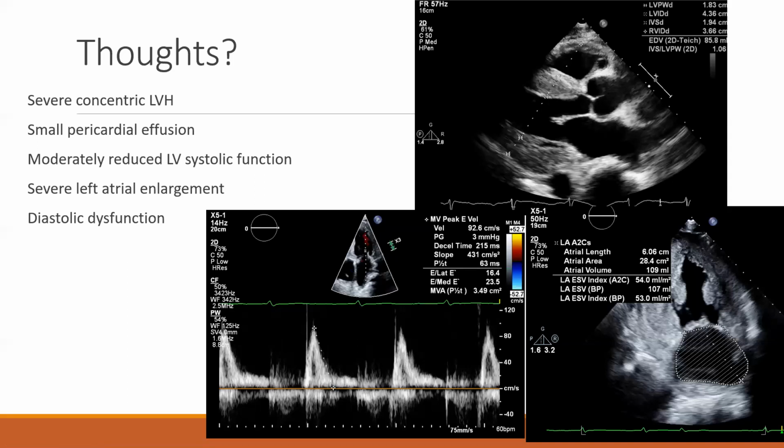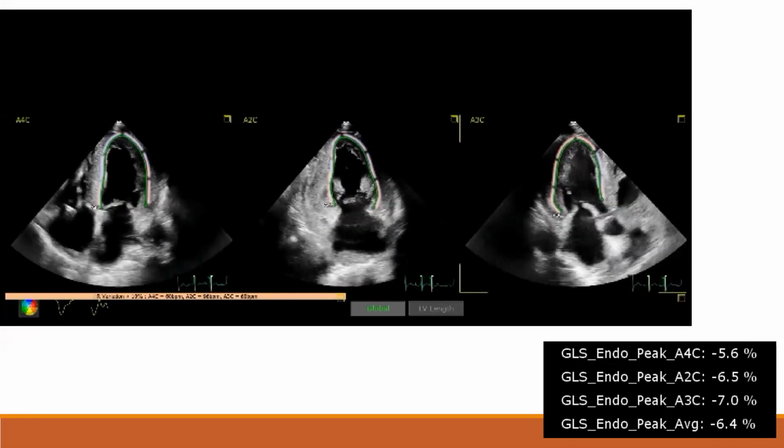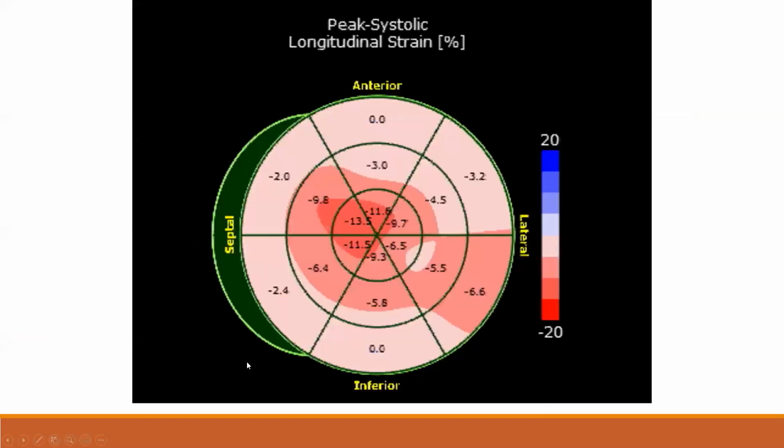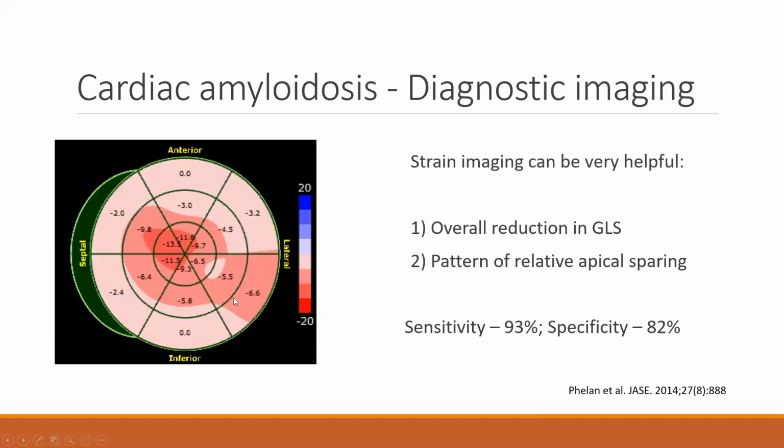And there can be multiple etiologies of this. In this case, as we heard from the last lecture, strain can be very helpful. This patient has overall reduced global longitudinal strain that preserves the apex. This is a characteristic finding of cardiac amyloidosis. And this is a diagnosis that's being increasingly recognized primarily because now we have therapies for it. There are new therapies for the TTR amyloidosis. Patients usually present with symptoms of right heart failure, but syncope is actually a fairly common presentation as well due to frequent bradyarrhythmias or advanced AV block, which was the case in our patient.